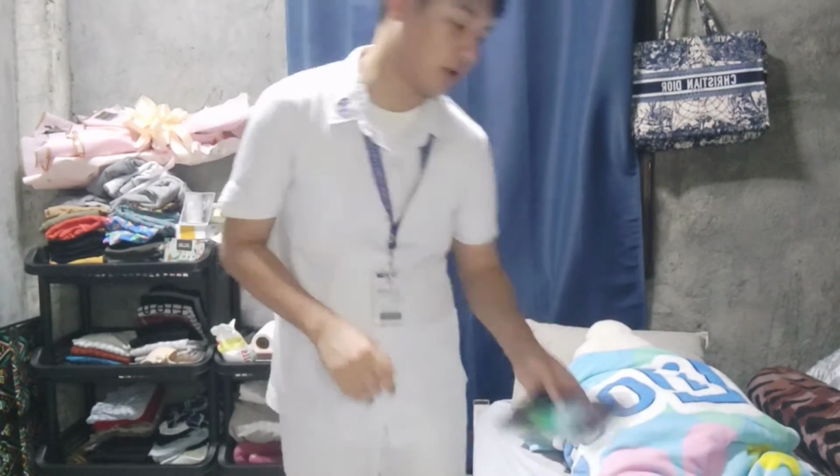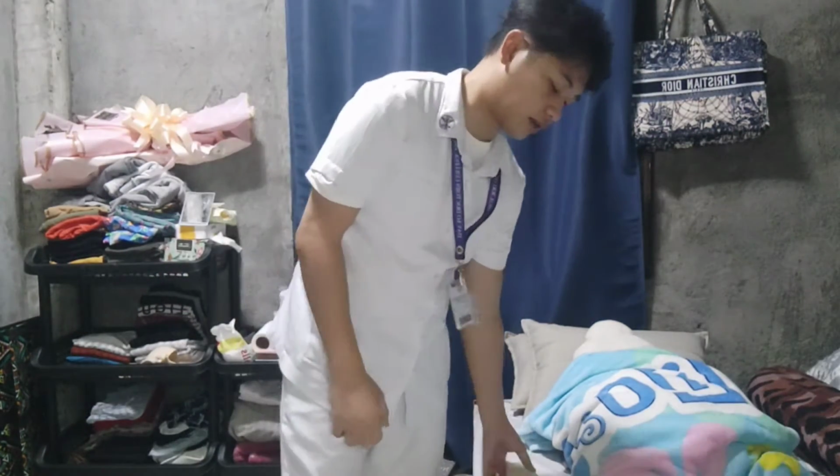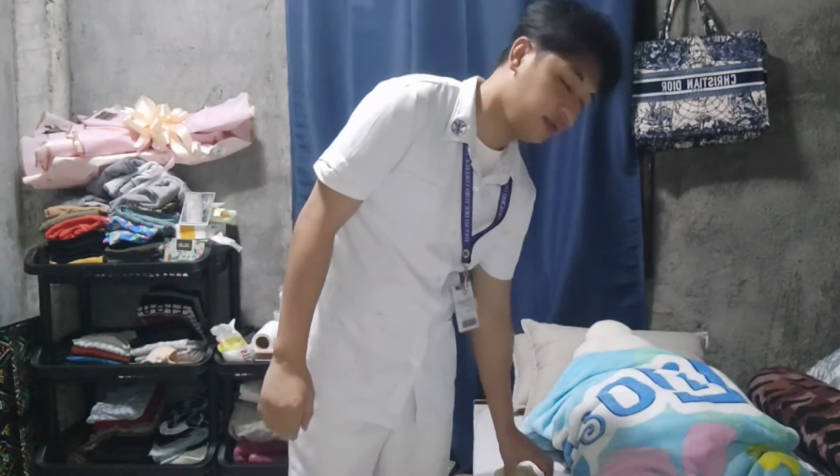Then next, we need to organize the equipment. The rationale is that it promotes time efficiency and eliminates delay in the procedure. So I'm going to prepare the medication and the things that I'm going to use. I'm going to use the gloves and the antiseptic alcohol. I'm also going to use the sterile water and the syringe, for easy access.